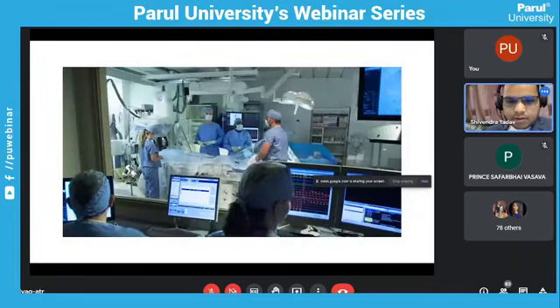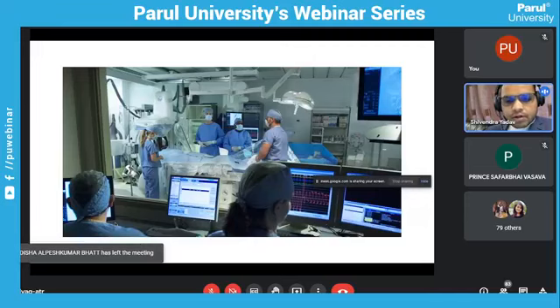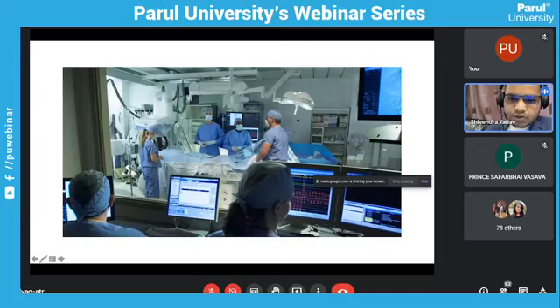Now this is a cath lab system where the hemodynamic monitoring is done. You can see not many of the people are inside the cath lab due to radiation exposure. So if a person's job is only to monitor a hemodynamic assessment, they can sit outside and they can communicate through a mic from inside. So as you can see, a technologist or a physiologist is responsible to monitor this pressure recording during the procedure, and the cath lab procedure is done inside.